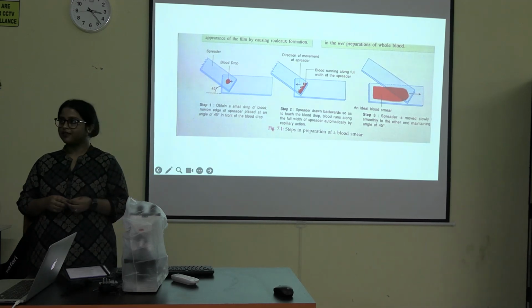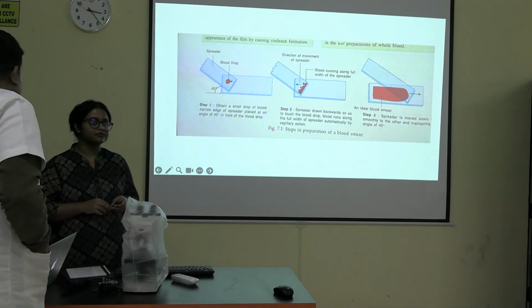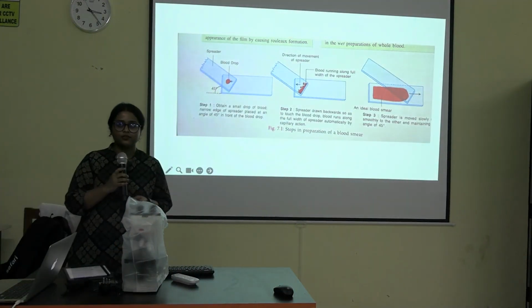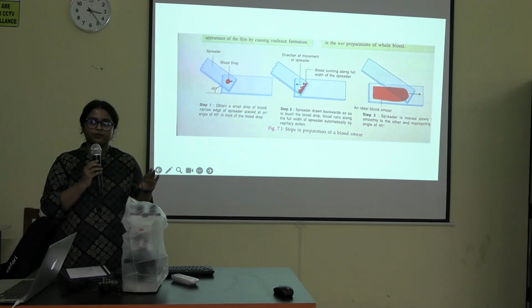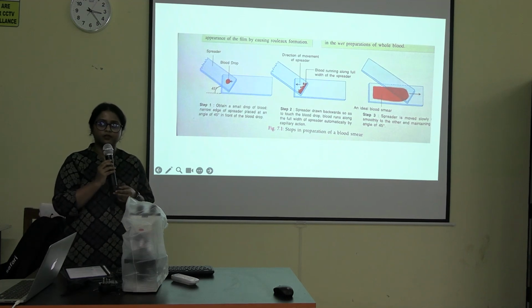Remember one thing. So let's see the procedure. So start with the procedure. Now we'll learn about it. We'll take 4 glass slides. Ideally, we should make 3 smears, but for practice, we'll make only 1 now. So we have to take 2 slides for that.